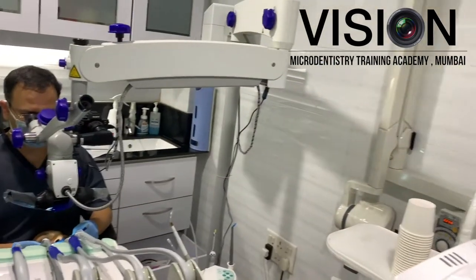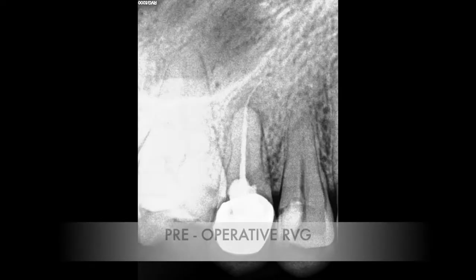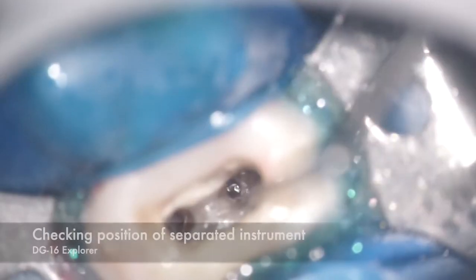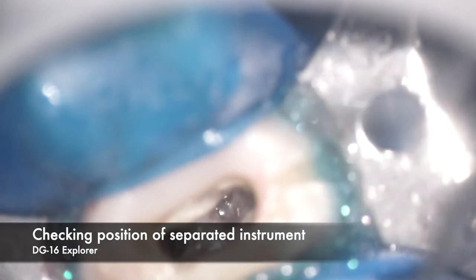Let's see how the case was presented. This was the pre-op RVG. The referring dentist had tried to do the retrieval but in the process accidentally happened to separate an NiTi file during the negotiation of the canal.